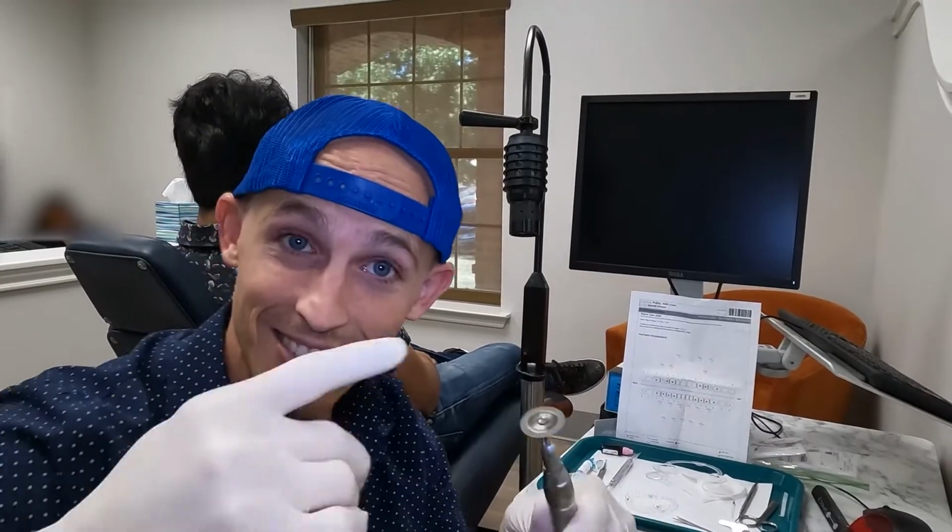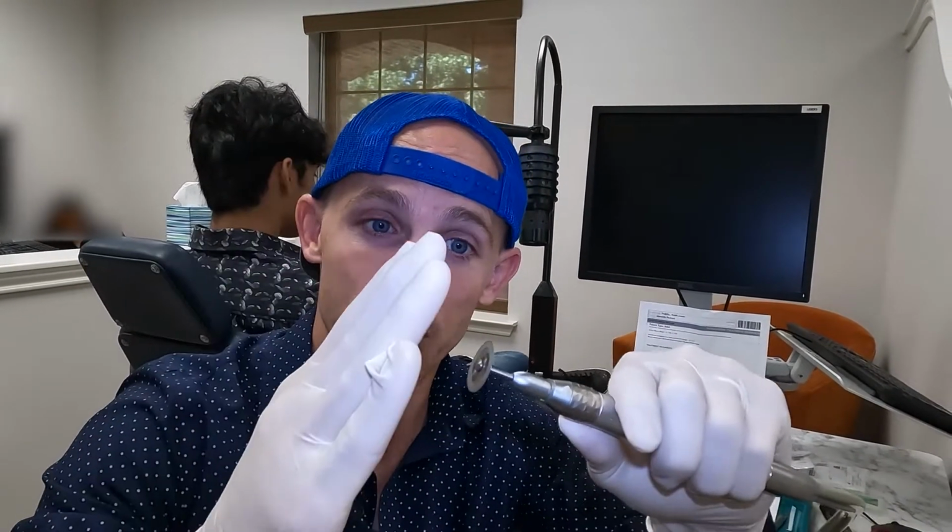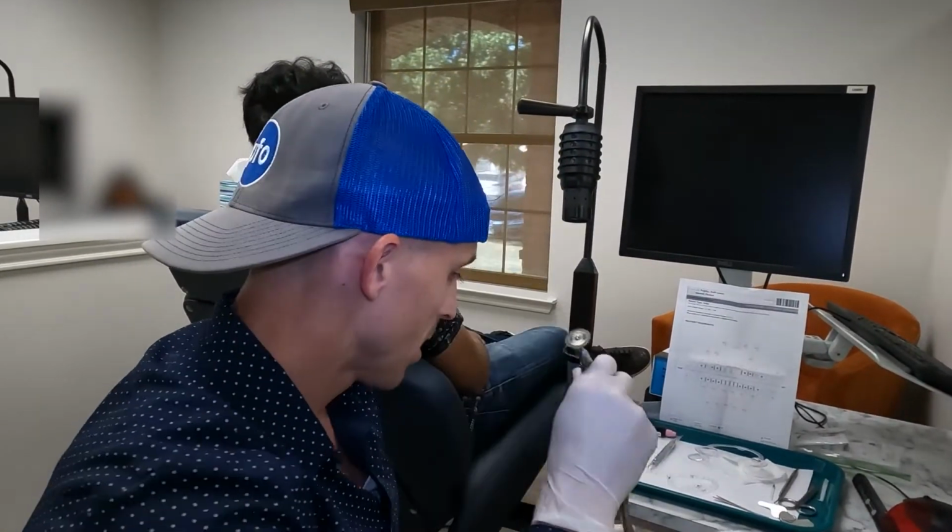It makes a sound, right? And it spins, and you can stick that through the teeth, and this rough stuff, it's like a diamond rough, it removes enamel, right? And that's how you get the spaces in between the teeth. So this is the most important part.